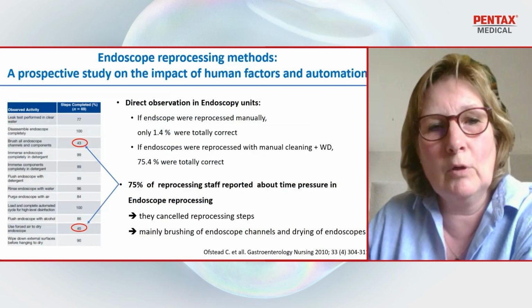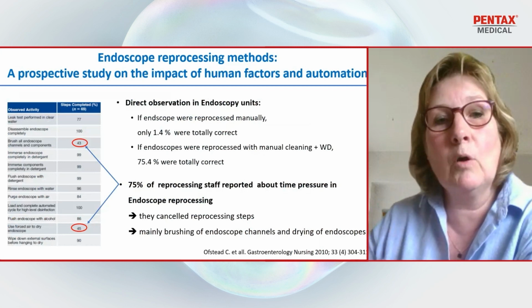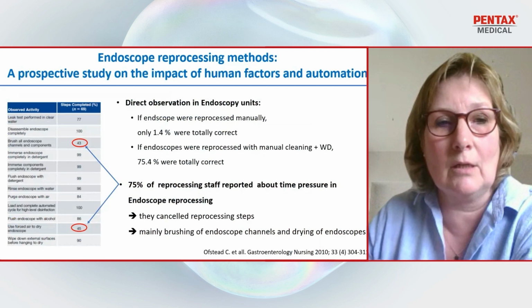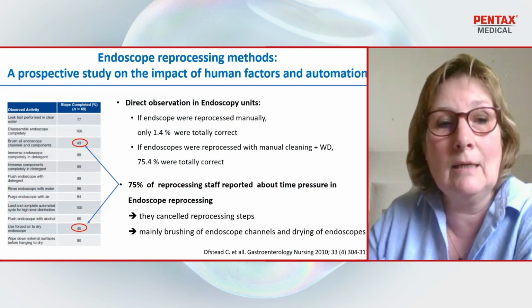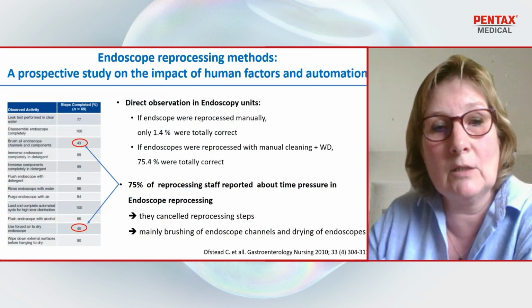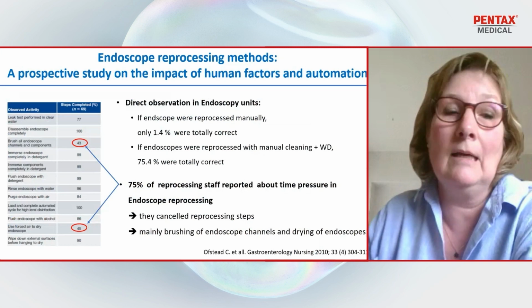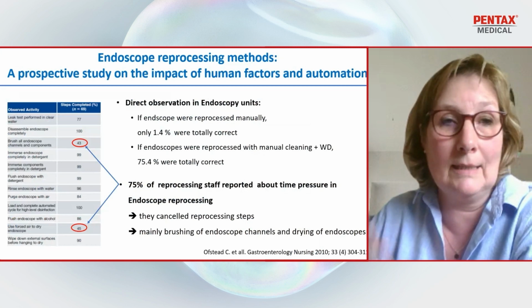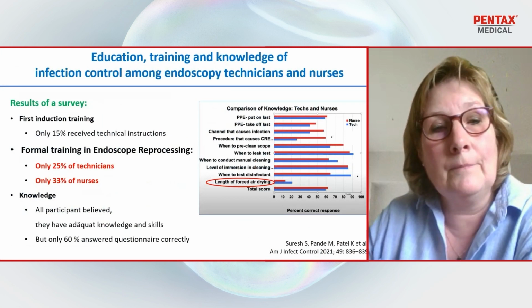The staff reported, and that was 75% of the staff, that they really work under high time pressure, and therefore they canceled reprocessing steps, especially the brushing of the endoscope channels and the drying of endoscope channels, and that really then are the reasons why it came to infections or transmission.